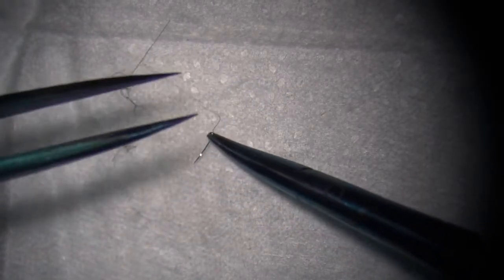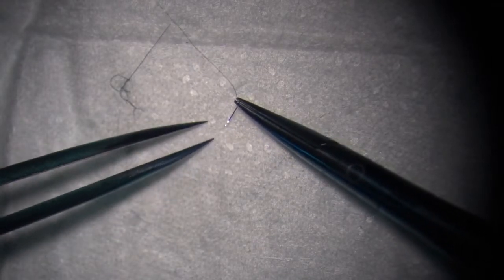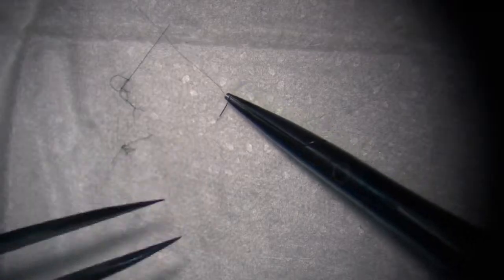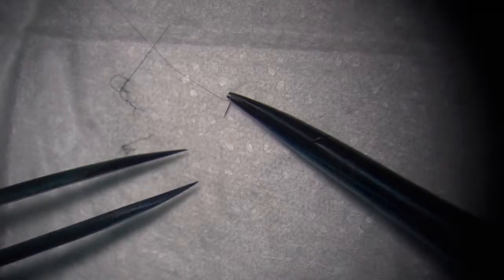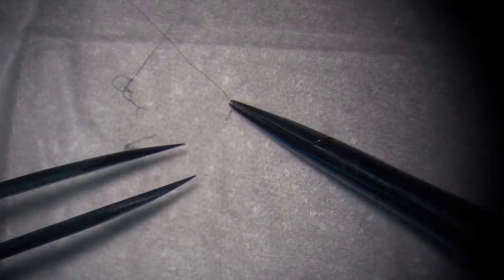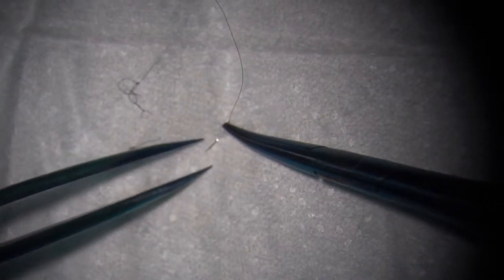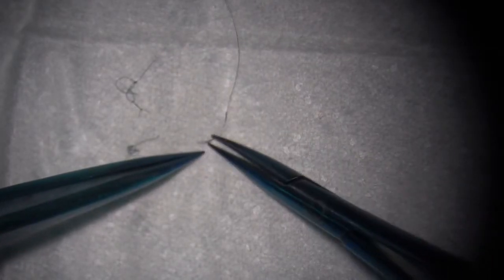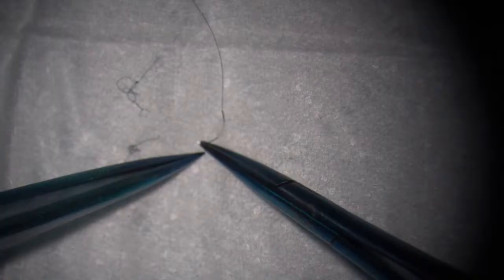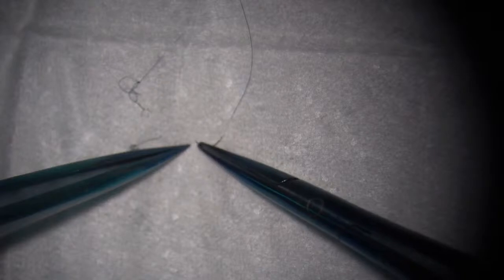Okay, so I'm happy with my positioning. Now, do you use your forceps to grab tissue, or do you just go straight in horizontally? It doesn't matter now. Sometimes when we stitch the vessel, we still use the forceps to pick up the adventitia to help us. And then you pull it all the way through.